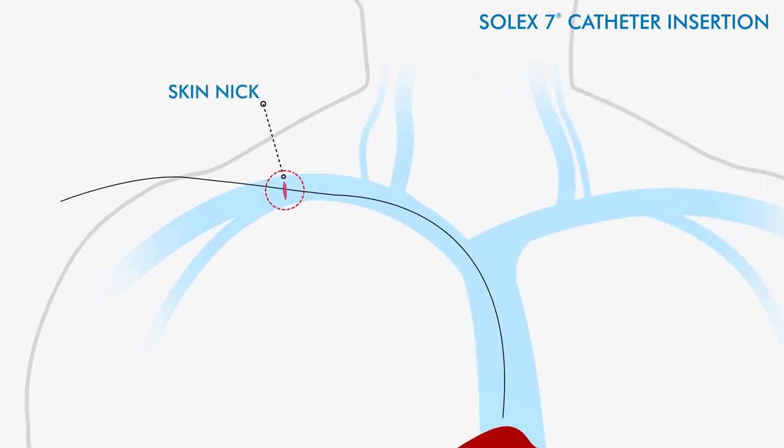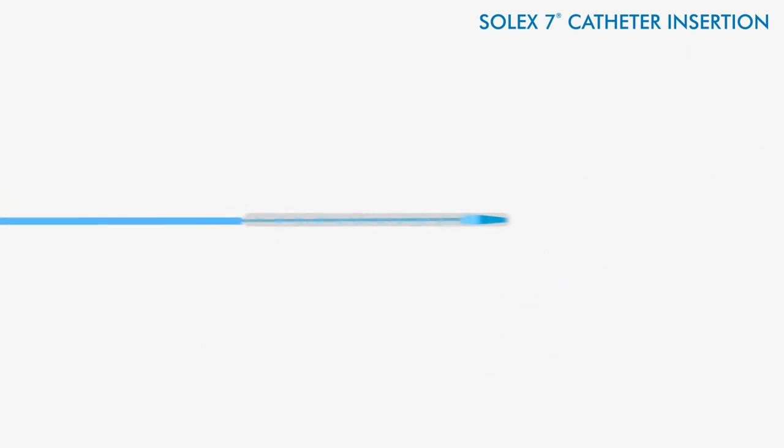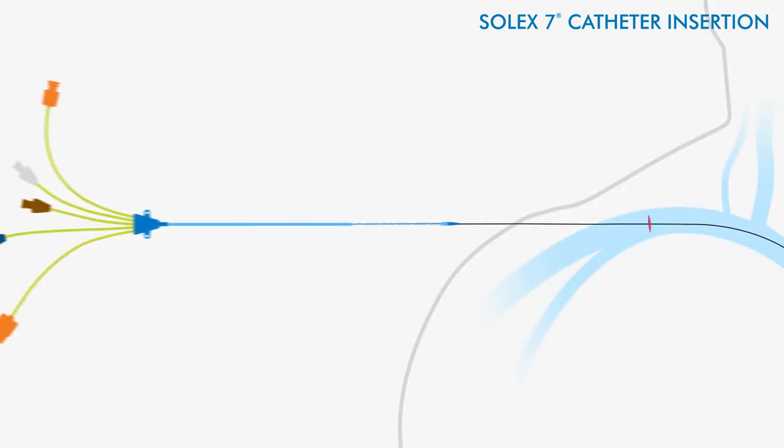Maintain venous access using an 032 guide wire. Dilate the vessel to prepare for Solex 7 catheter insertion. Remove the plastic catheter balloon cover and insert the Solex 7 catheter over the guide wire.